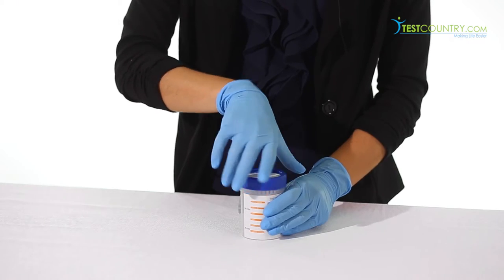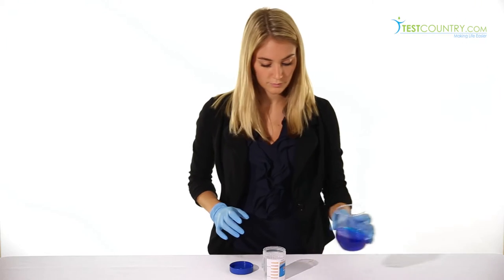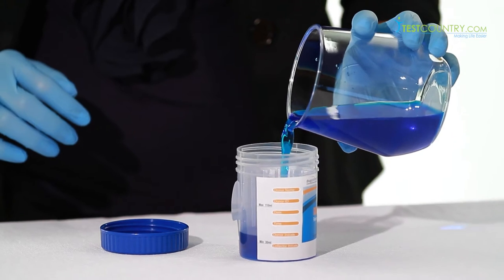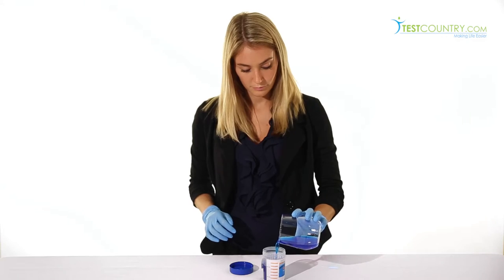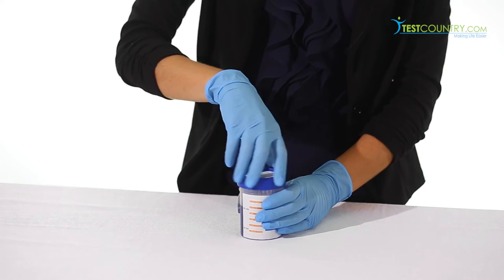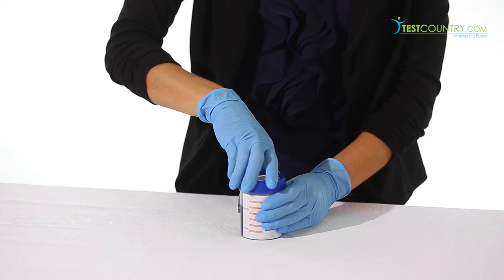Since the test procedure for all of these cups is identical, I'll show you with the Drug Confirm Advanced Cup. To start the test, unscrew the lid and collect the specimen. Take notice of the convenient fill indicator line between 30 and 100 milliliters to ensure an appropriate level of specimen collection. After the specimen has been collected, fasten the lid securely and return the cup to the collection official.